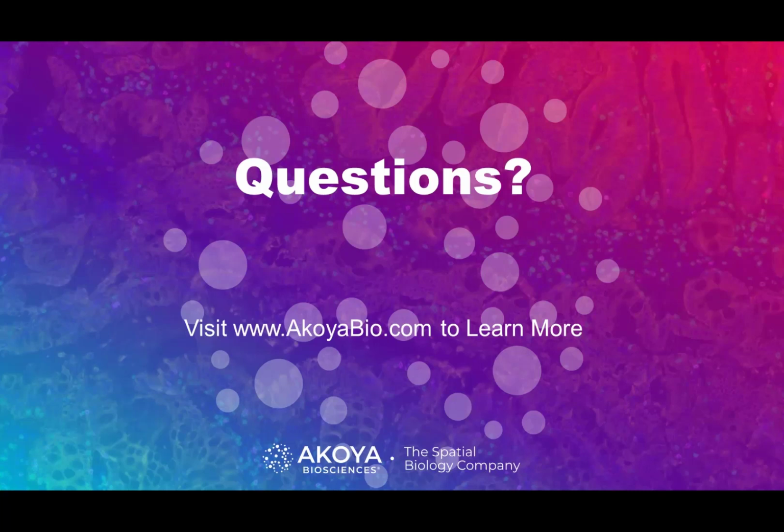The next question was, could the deep learning be applied on CODEX images? I don't see why. That's a good question, actually. What's the format of the images for CODEX? Does Clemens happen to know? By the end of the year there'll be QPTIFFs, and that's perfect. QPTIFFs is more or less what I've been using, and that works great in Visiopharm.